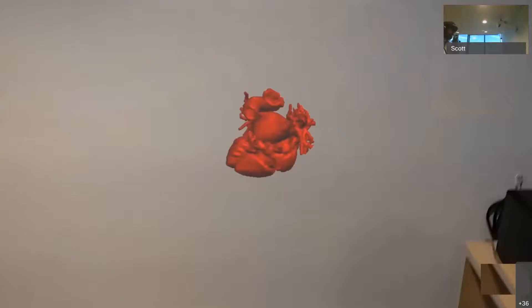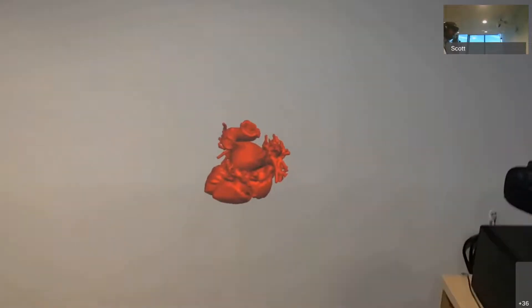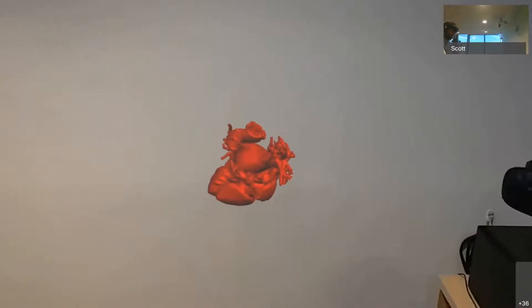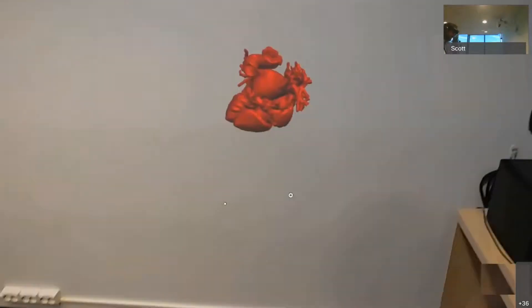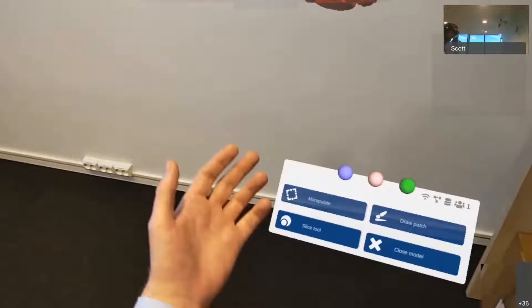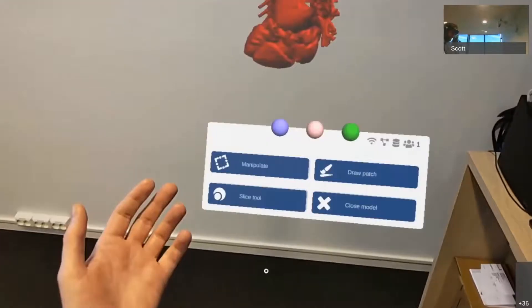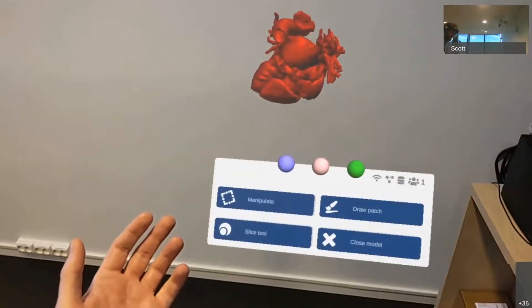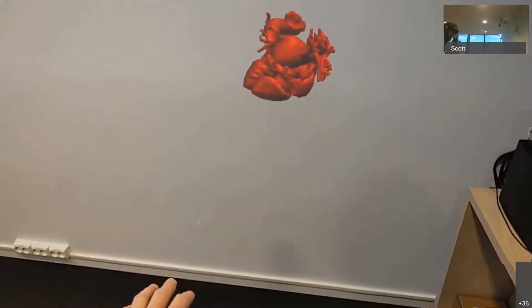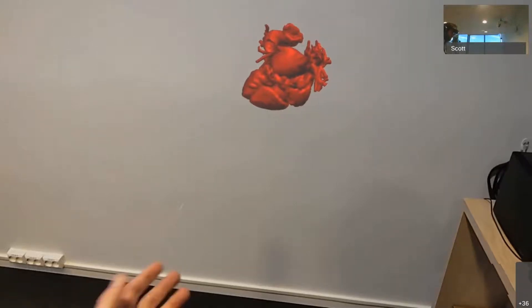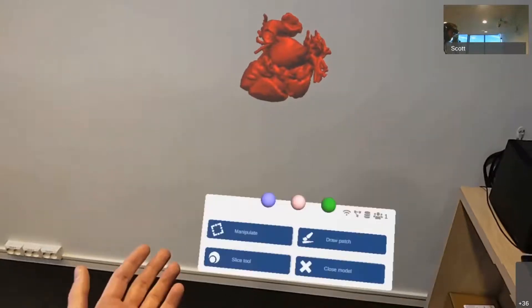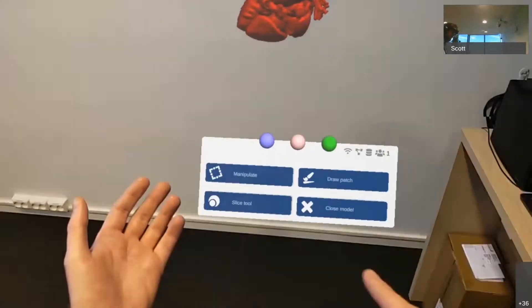And if we want to interact with the heart, we've got to bring up the context menu. The HoloLens 2 has got hand tracking, so I can bring up my hand palm up, and a context menu will appear. And I can make that disappear if I don't need it. And I'm going to choose the Manipulate button.